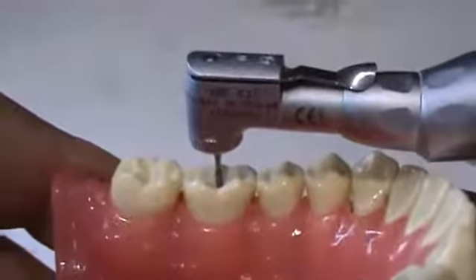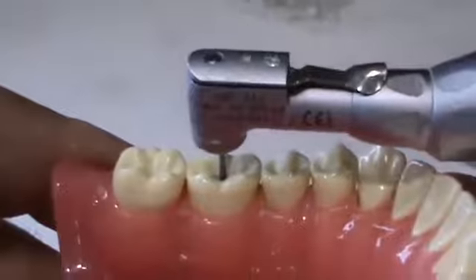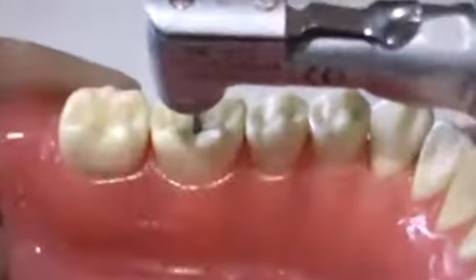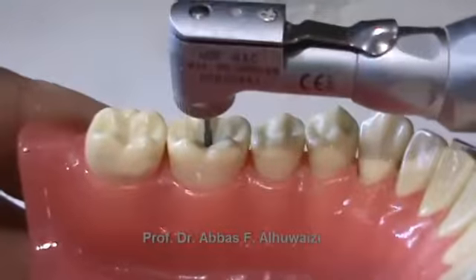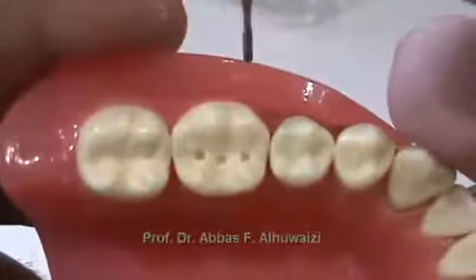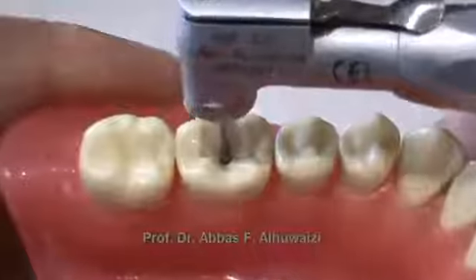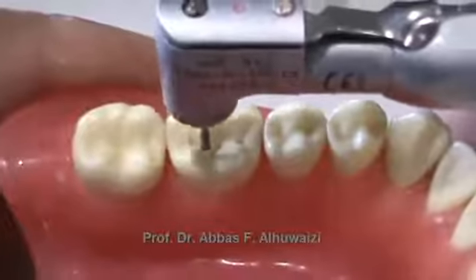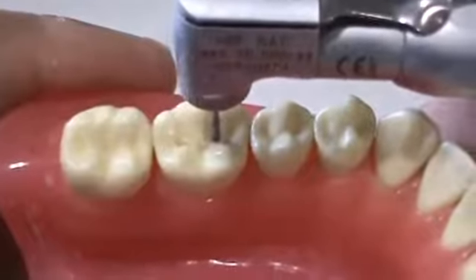Notice that the fissure burr should be placed on the floor of the depth of the hole to make a uniform depth of 1.5 to 2 mm for all the cavity.